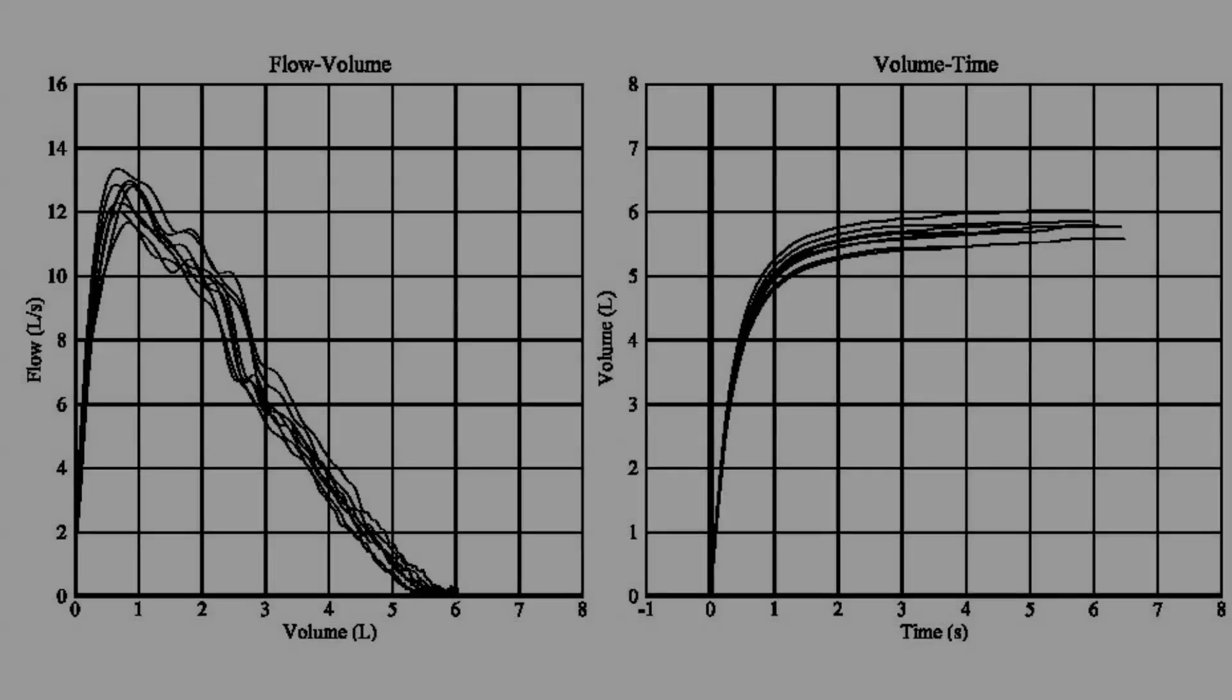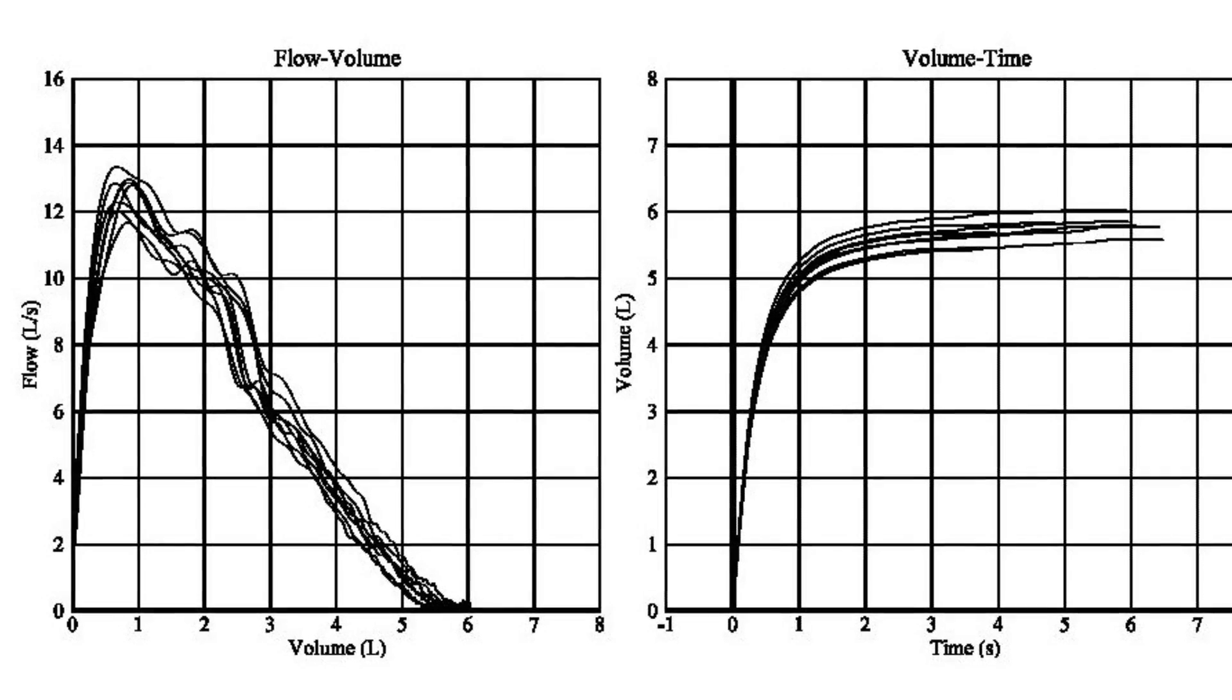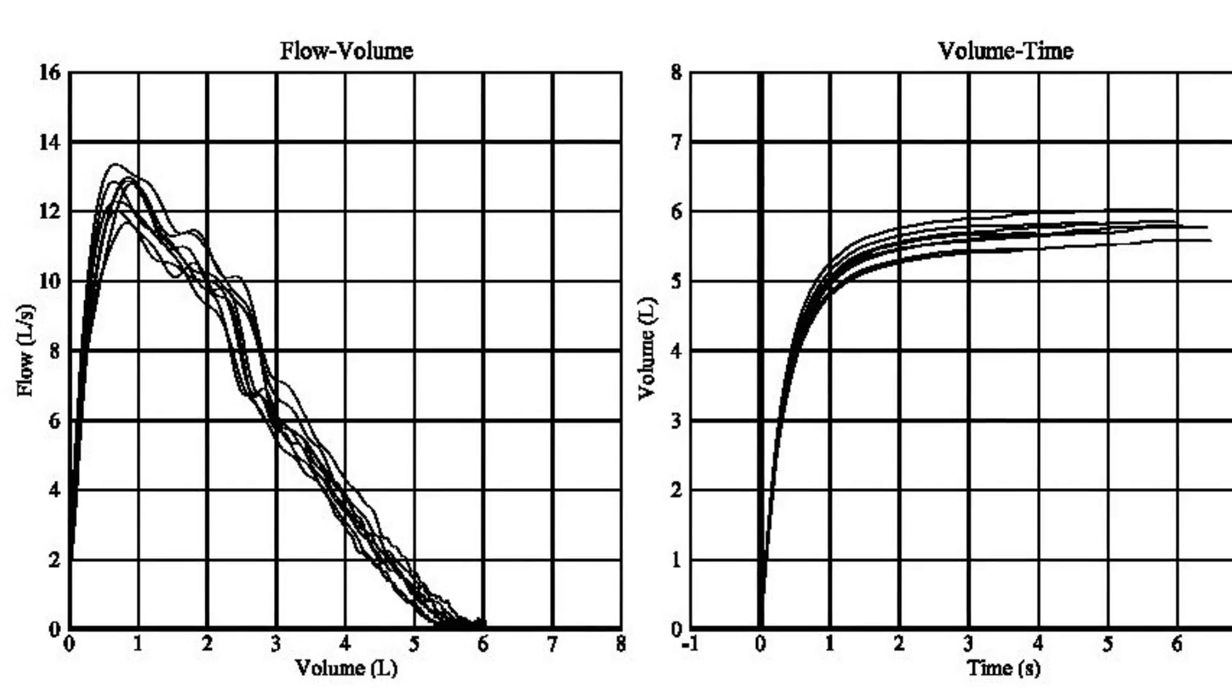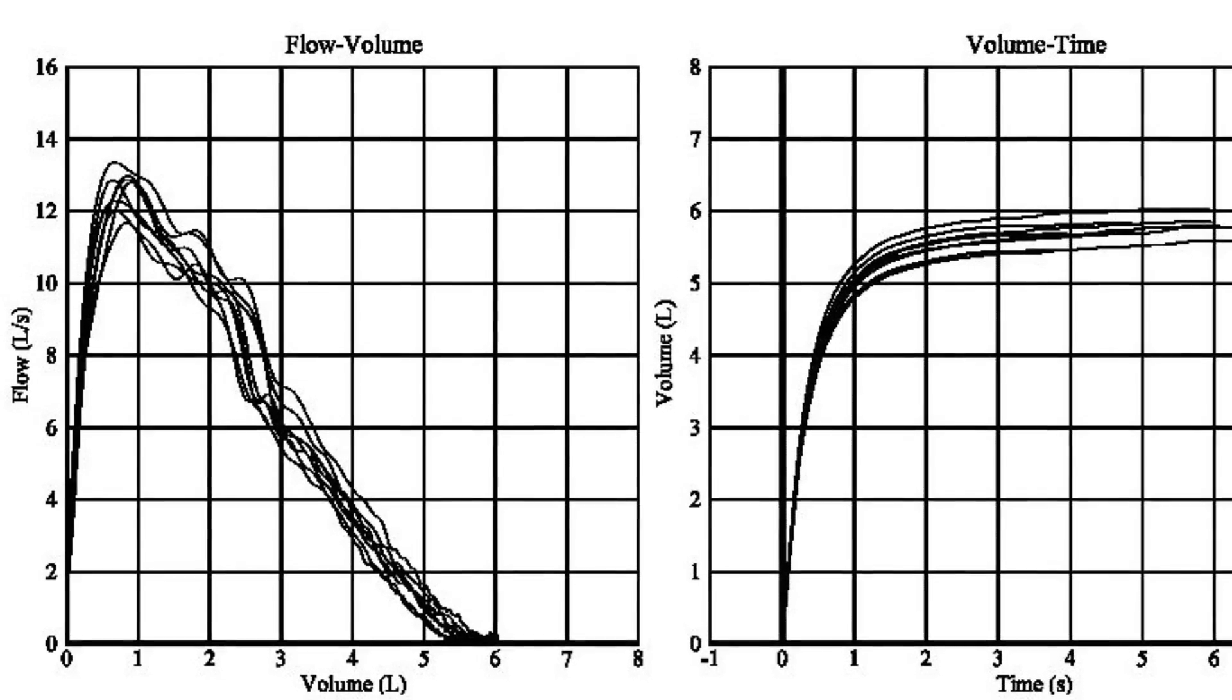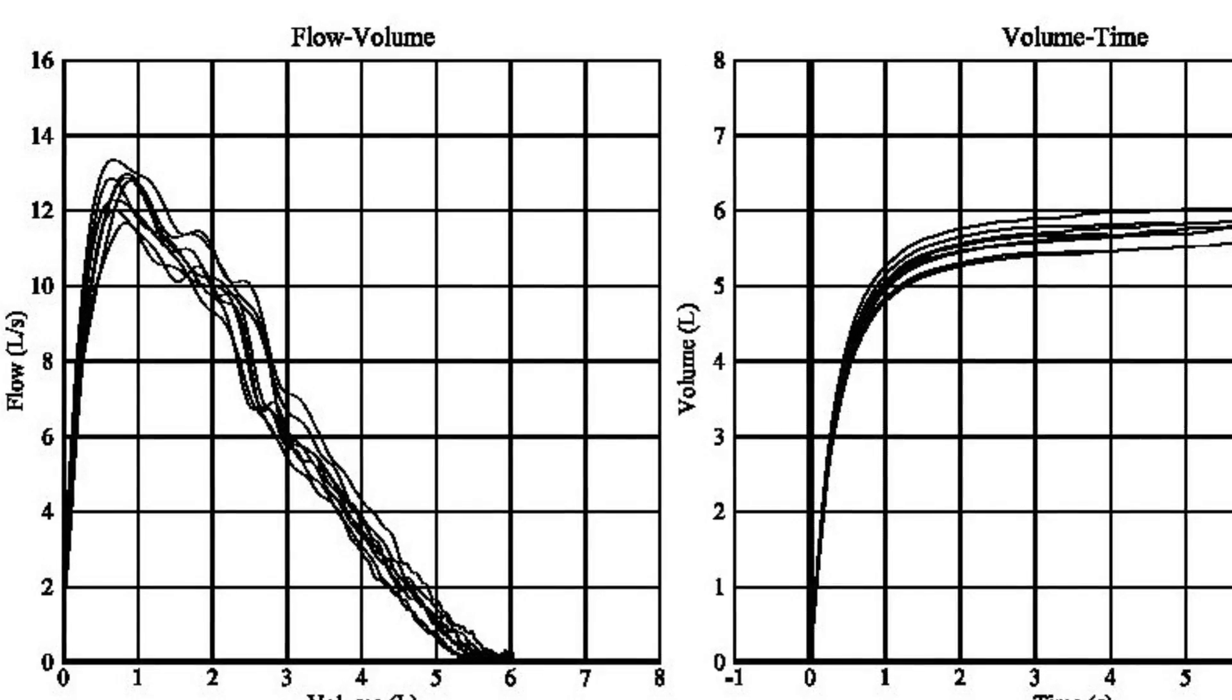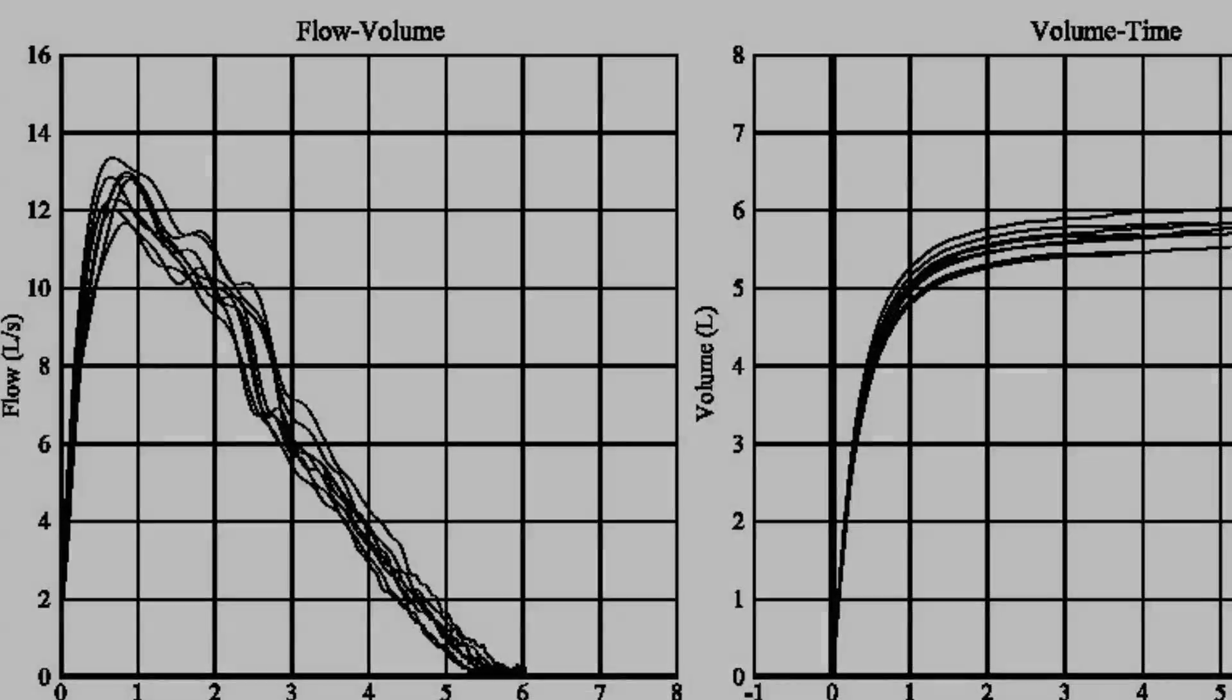Sometimes the effort is not consistent, and the graphs can become cluttered. These graphs are anchored at time zero, and therefore overlap. This has the advantage of easily showing the relative peaks and duration for the curves, but can be difficult in some cases to pick out an individual maneuver.